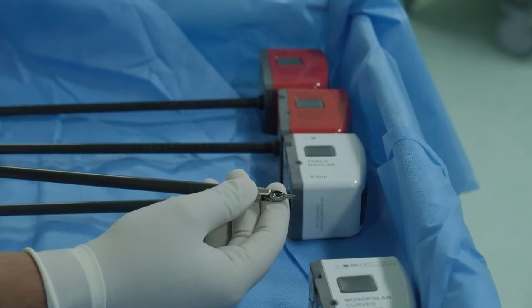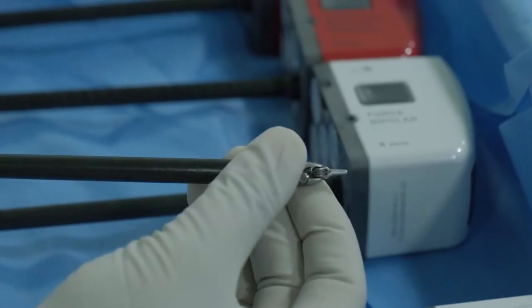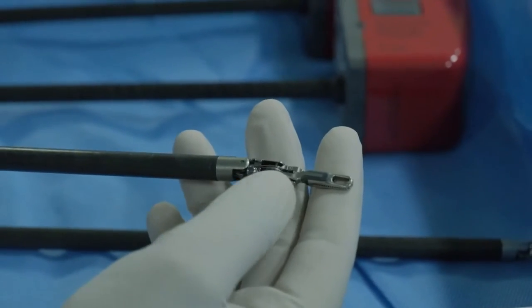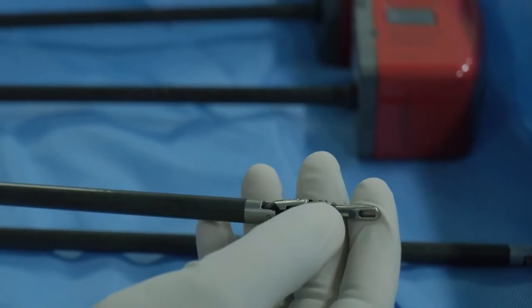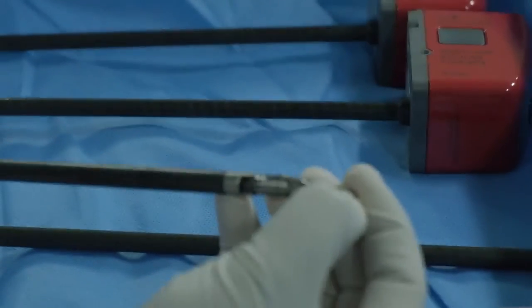And all these instruments are controlled by these fine wires and fine pulleys at the tip. I'll show you the force bipolar where you will be able to appreciate it in a better way, how there are fine wires and pulleys which actually control the movement of the instruments.